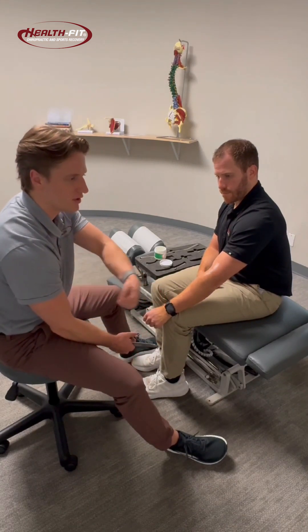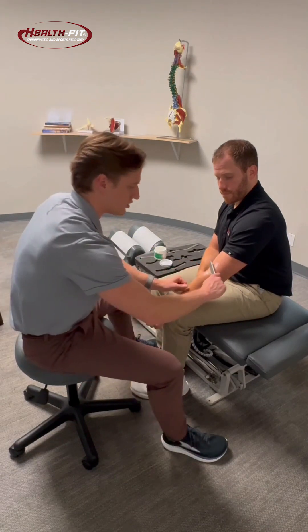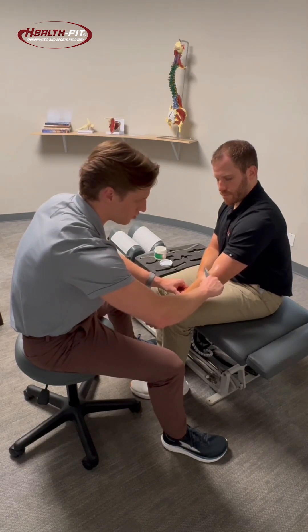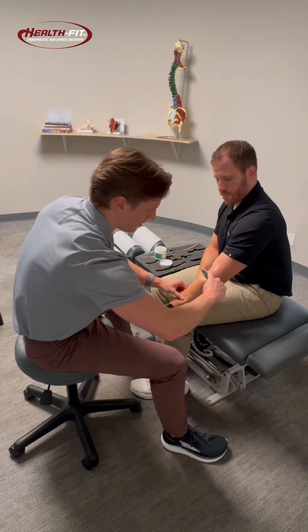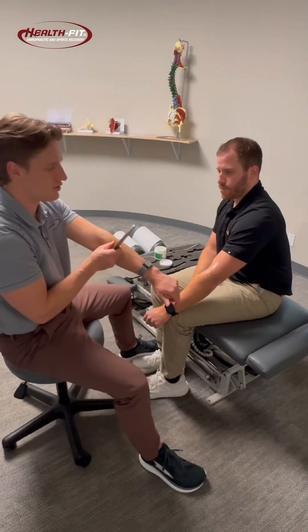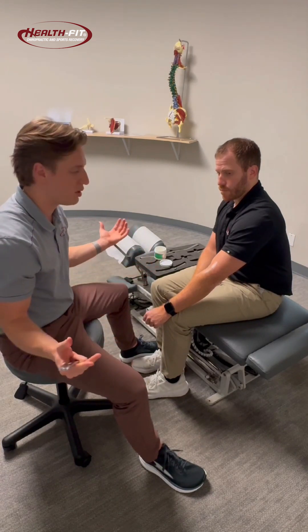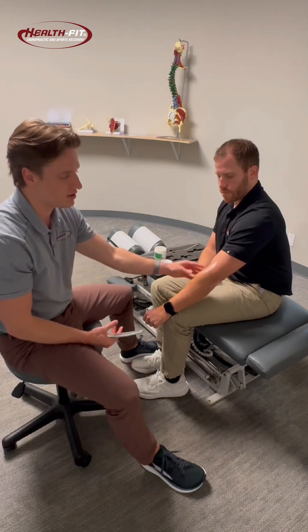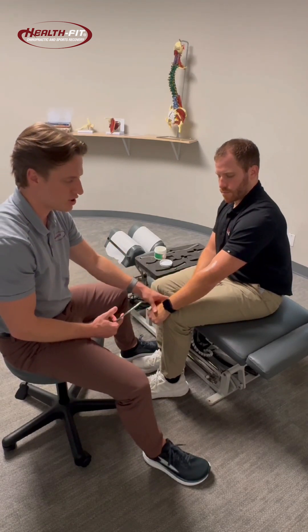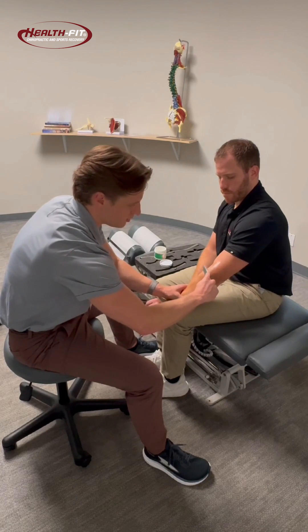With tennis elbow, think about backhand swings — that force comes in to where those tendons attach up at the lateral epicondyle. We're going to work through that area with small rapid strokes and also longer, more drawn-out strokes. I can flip the tool and work through the area as well. What this is doing is causing the tissue and fascia underneath to shear on one another, helping break up scar tissue and fascial adhesions, and promoting an abundance of blood flow to the area — which is what brings in those healing properties and growth factors. Matthew will go through some range of motion while I scrape, so you can see his forearm muscles working.